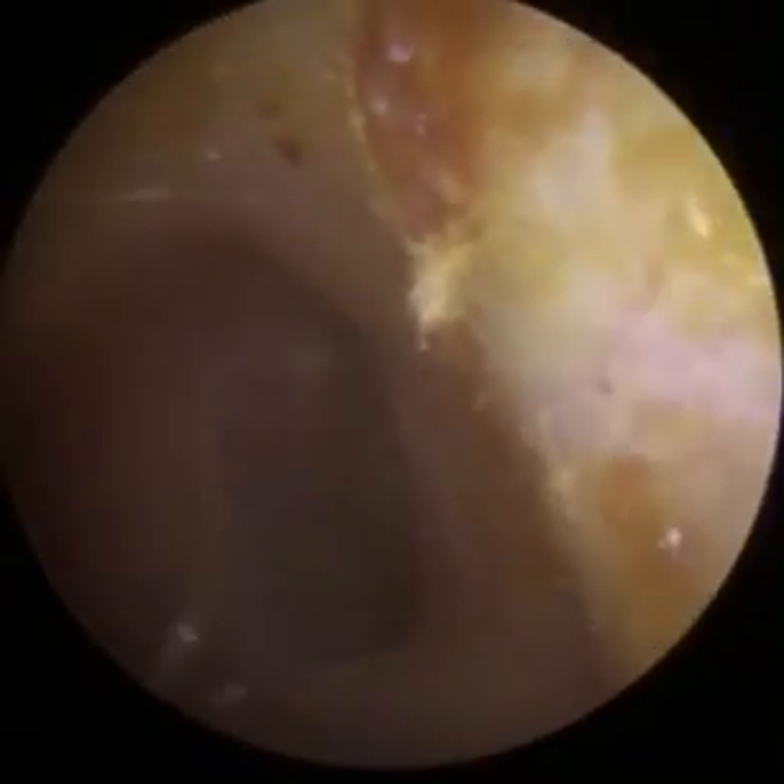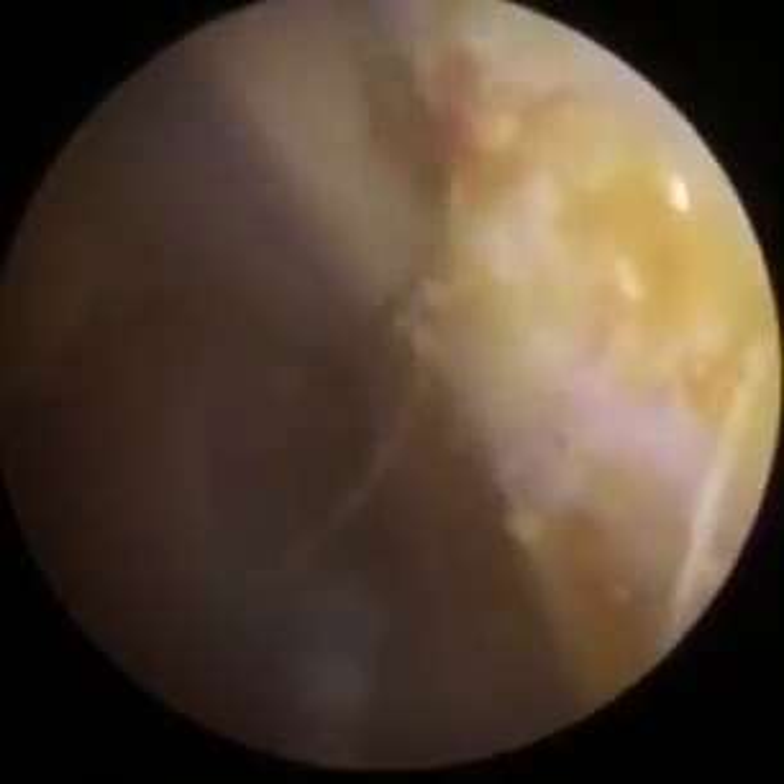Here we go. Again, the ear canal is completely clear. You've got a bit of wax around the edge. As I said, that's more or less healthy wax, but we'll just get some out.